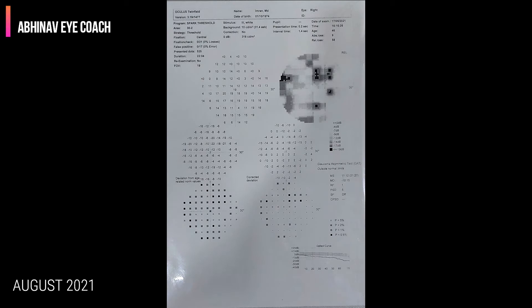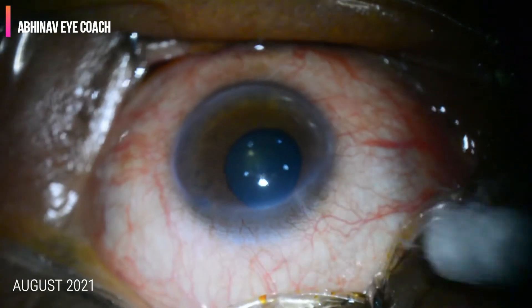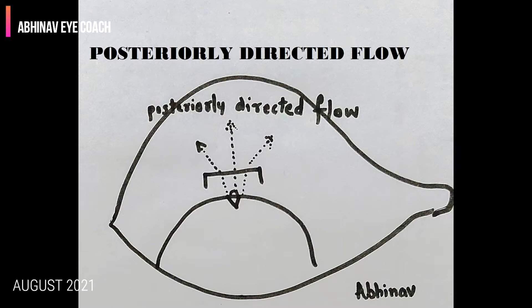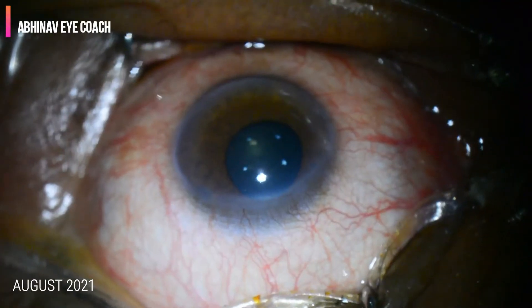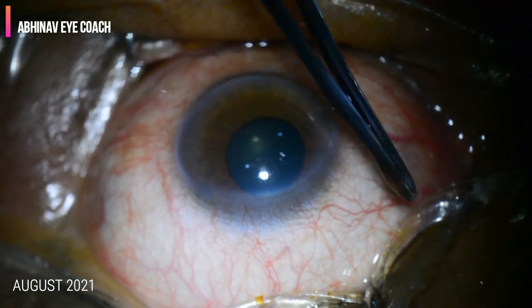We should carry out the visual fields of the patient in advance. Both visual fields are showing advanced visual field defects. The patient profile is a 35-year-old male with primary angle closure glaucoma with advanced optic atrophy. The target is to achieve a posteriorly directed flow in a post-trabeculectomy bleb.